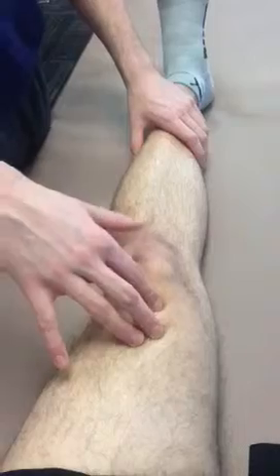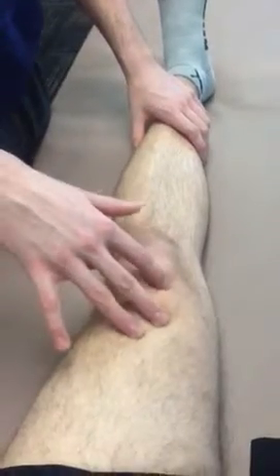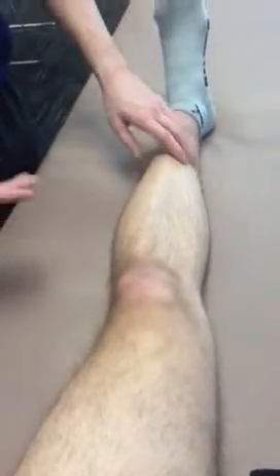The second thing I would do is verify the presence of contraindications for the treated area. Today we're going to be doing a stim on the VMO. I would look to see if there's any bruising, scarring, any new wounds, anything like that. And if I had a female patient, an older patient, I would ask them if they were pregnant. That would also be a contraindication in doing stim.